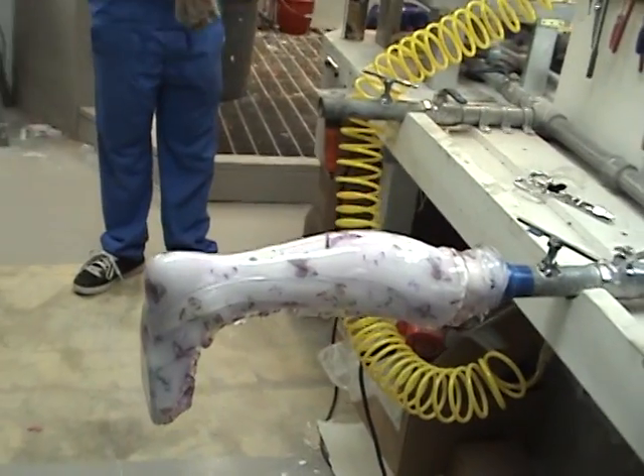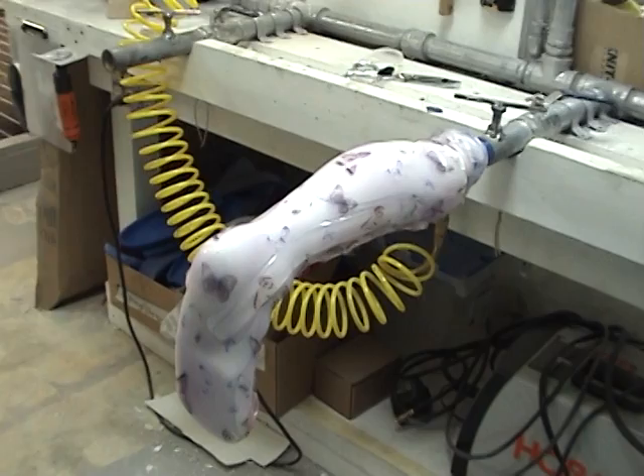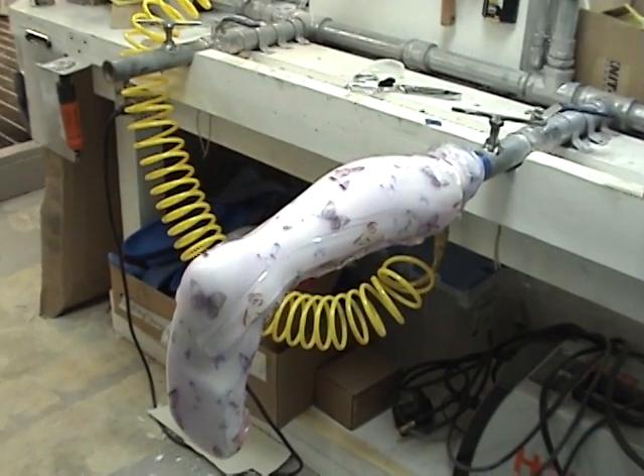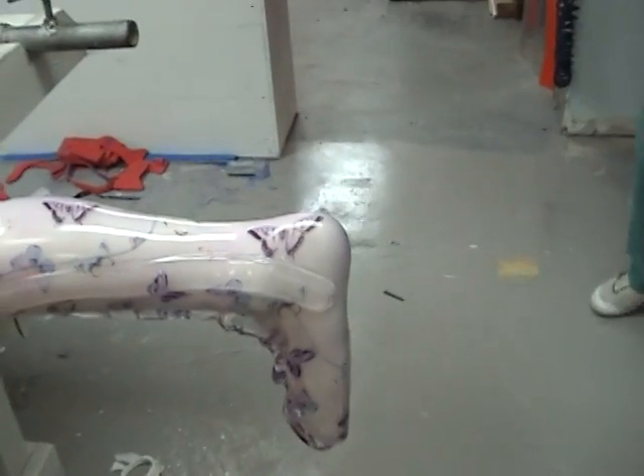We extend the medial strut into the arch to limit that mid-arch break — you can see it there. And then the lateral we just extend down to just below the lateral malleolus, as you can see there.